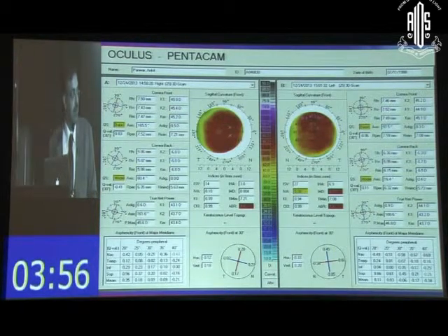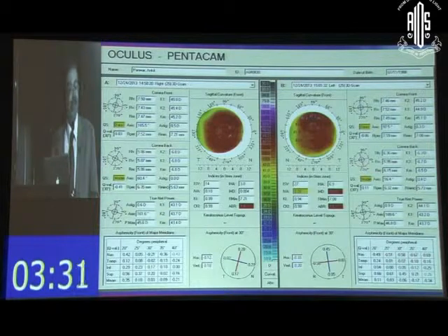If we start off with a 41 diopter cornea and say a 500 microns thickness, you might leave it behind, drop it down to 35 and bring it to 450. But it's not the same as bringing down a 600 micron cornea to 450, because the amount of spherical aberration that you induce, even if you're using an aspheric profile, is going to be extreme. So it's not just the numbers alone, but you need to look at what you're starting with and where you are ending up at.